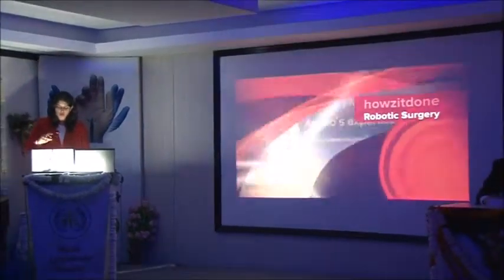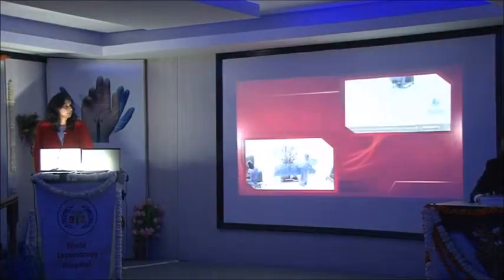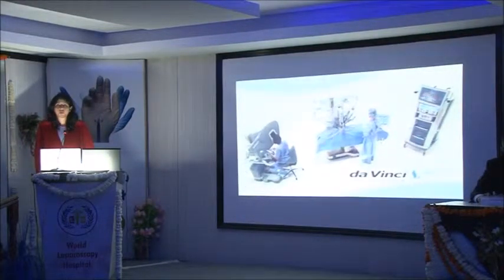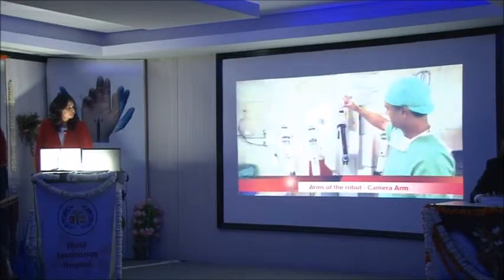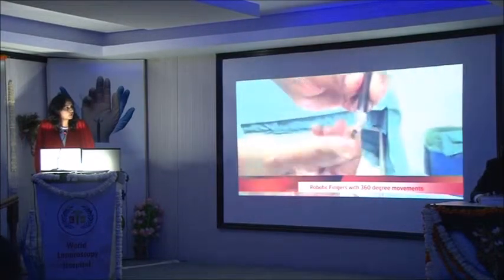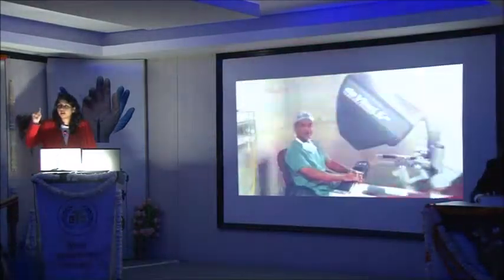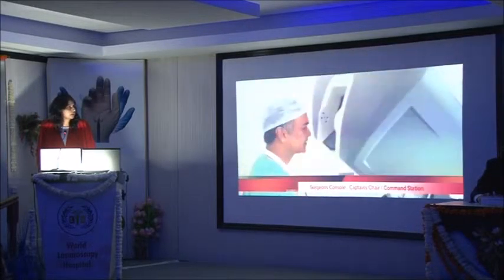Let's go through this short video of how the robotic surgery actually is done. We at Indraprasth Apollo Hospital are doing various robotic procedures in urology, gynecology, urogynecology, general surgery. Even the pediatric surgeons are doing robotic surgery. And in this video, we're talking about the various arms of the robot. You can see that the movement at the wrist of the instrument is 360-degree movement. Even the human wrist doesn't have as many degrees of freedom as the robotic wrist has. It has 7 degrees of freedom. It can move in all the directions.